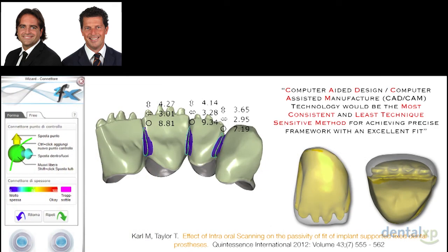And then, of course, it's all Matteo and Luca's work. Thanks to the new digital possibilities, they don't need to work on the function, because these 2 grooves were done by the patient, so they don't need to change that because this is exactly customized by her. They need to work with their traditional knowledge. Which are the weakest areas in this patient? The incisal margin. So let's do this specific design that they have invented, that they created, and it is called ZIL, zirconium incisal laminate design.